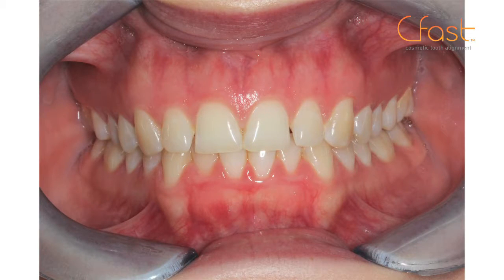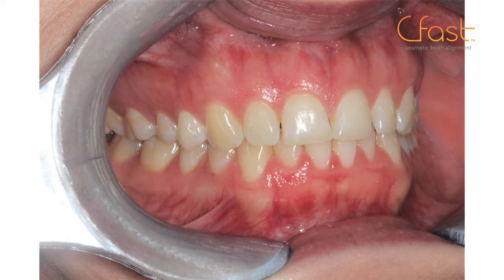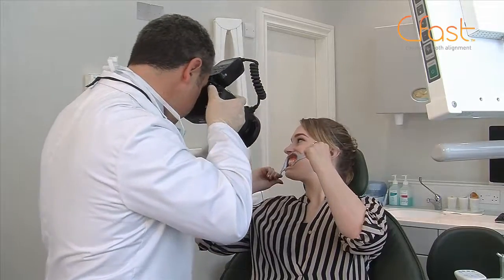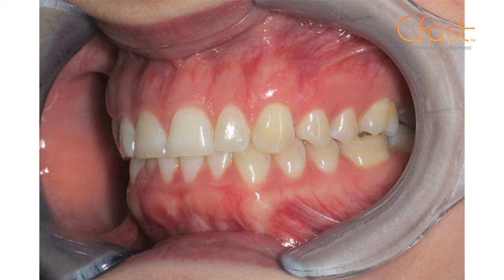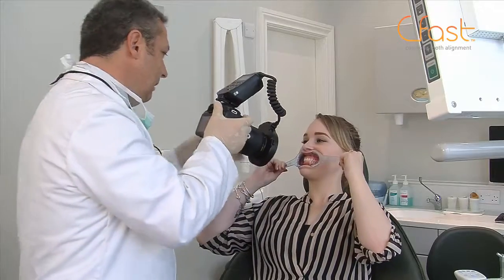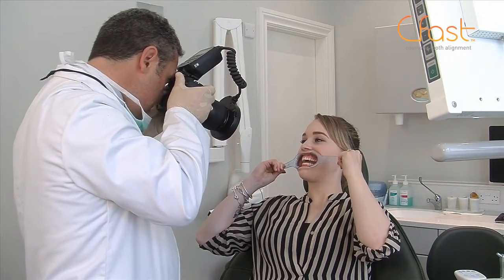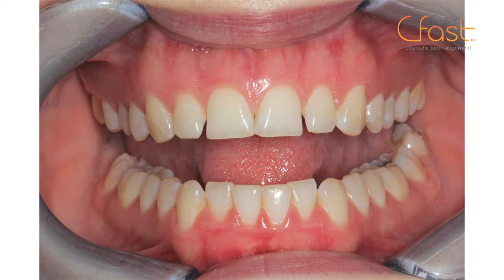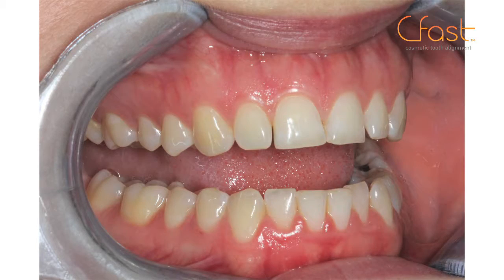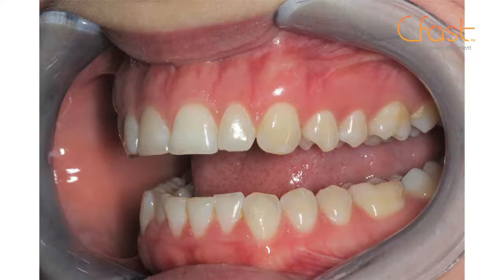So we take front, left, and head to the right, please. Right. Okay, and then back to the middle. Now just open your mouth up very slightly for me now. Big wide mouth. Okay. Front, side, and head over to the other side now, please, Heather. Let me see our views.